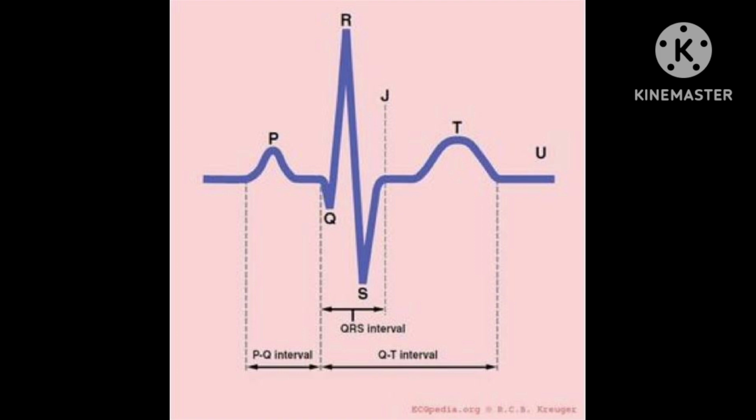The muscle produces only a little current, and a little current is very difficult to study. That's why it is enlarged. The current is shown in a big way, which means it is amplified.